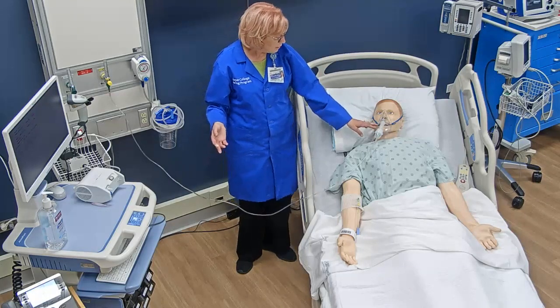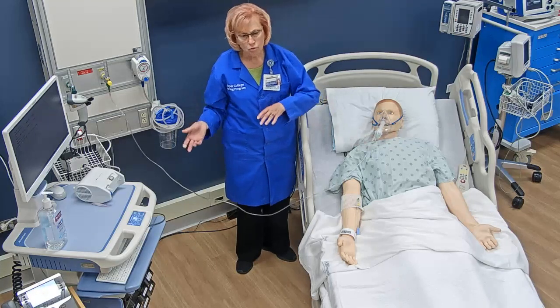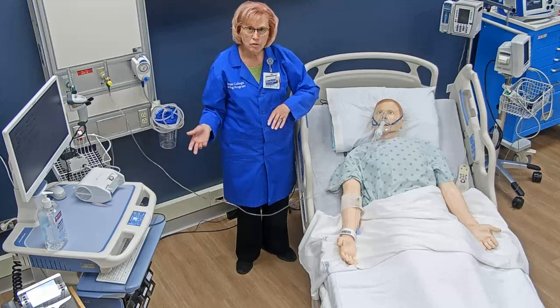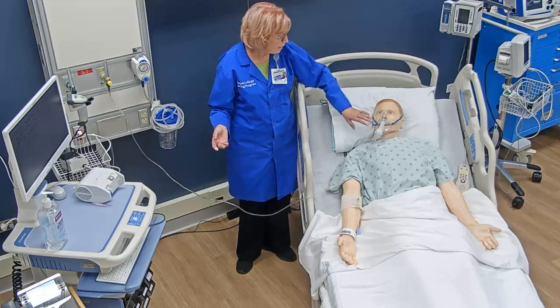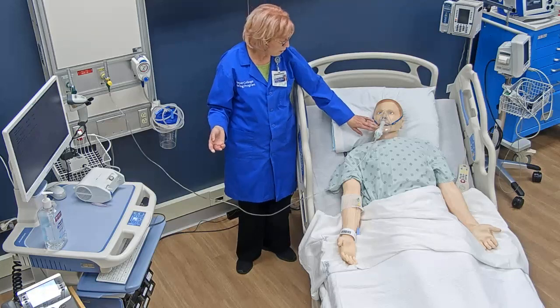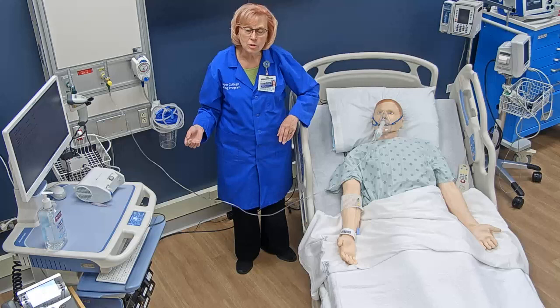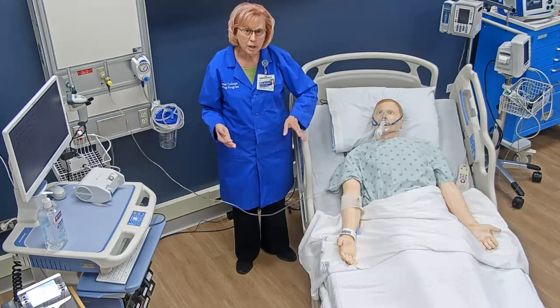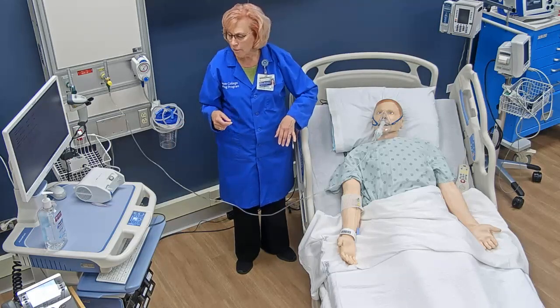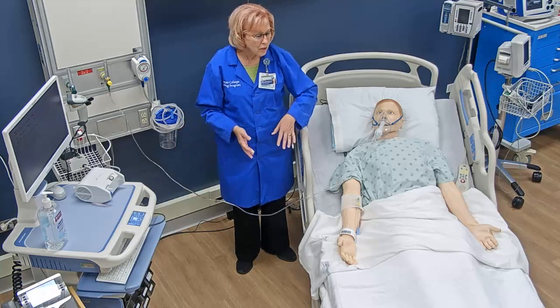Once this is all completed, you can remove the mask and you can store it away, and it's ready to be used again for the next time. The mask can be reused as many times as you need in order to give the medication. Make sure that you assess your patient before giving the medicine and also after giving the medicine, and document any changes. And that's all for administration.